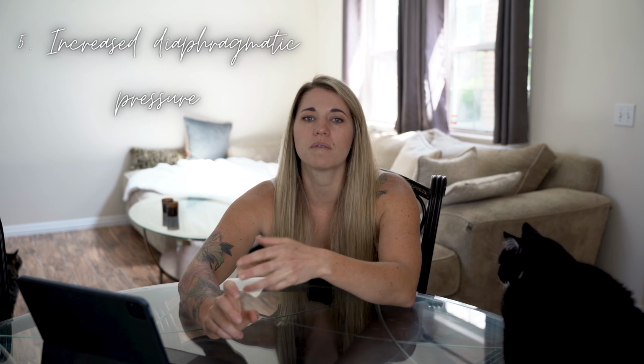and then even in some laparoscopic surgeries, if the patient has too much abdominal tension or for other reasons, they may benefit from paralyzing the patient. Also, paralytics help you to decrease your other anesthetic agents and therefore help to stabilize your patient. So if a patient is paralyzed, they have lost use of their intercostal muscles and diaphragm, therefore they require positive pressure ventilation. Other patients who may benefit from positive pressure ventilation but maybe don't require it are obese patients, pregnant patients, and again, patients undergoing laparoscopic procedures.